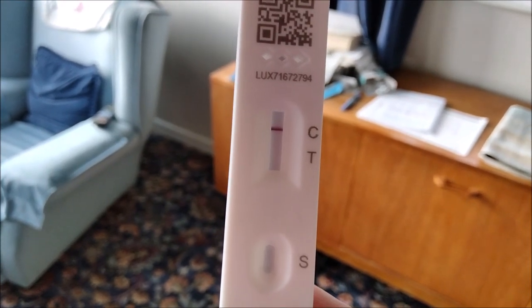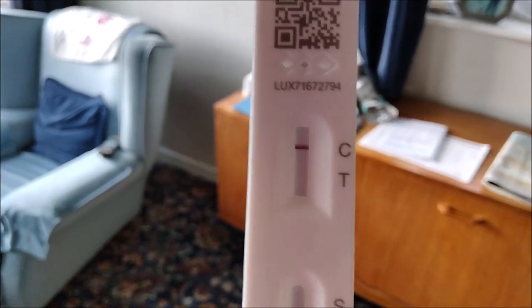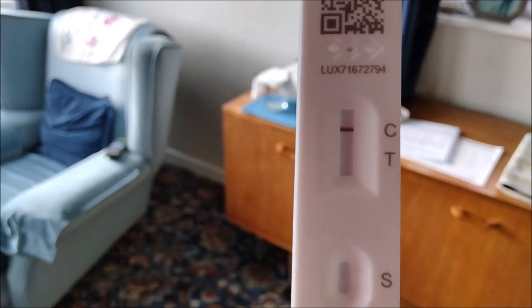This is about an hour later. You will see there is a clear red line up at the top, and that means that my result is negative. So this means I can go and get my hair cut. Don't forget to record your results on the NHS website, where you can record your results — the NHS are aware of who is taking the test, and you will see all the details in the booklet that you get with your lateral flow test.